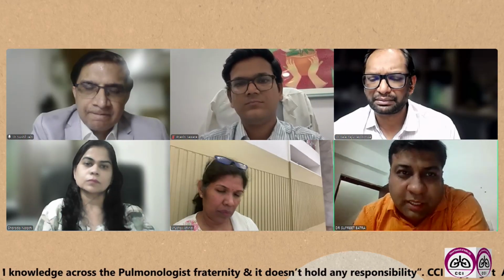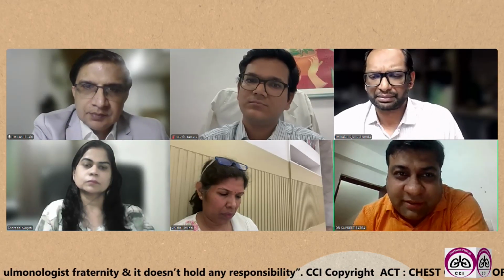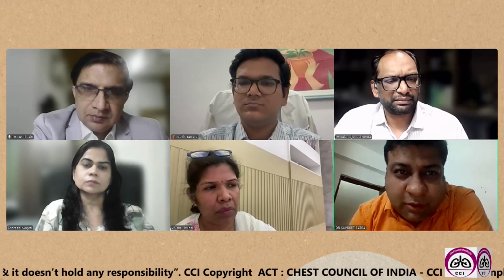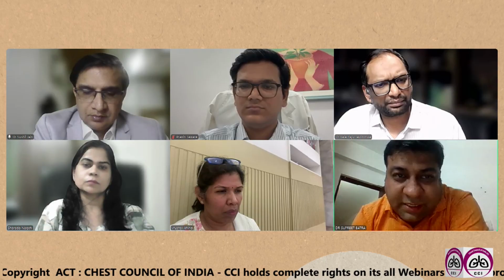Yes, sir. If a node is necrotic, we usually use aspiration or suction because sometimes we get pus also. In that case, we use suction to see if there is any necrotic material or pus. And with the passes, since we know it's a necrotic material, we send them more for cultures rather than preparing fewer slides.